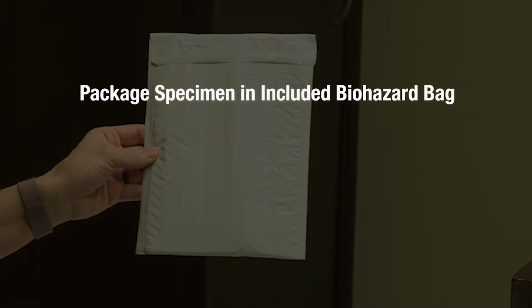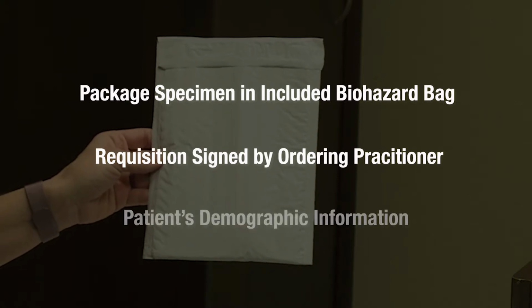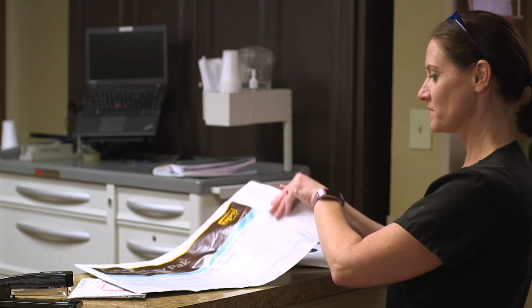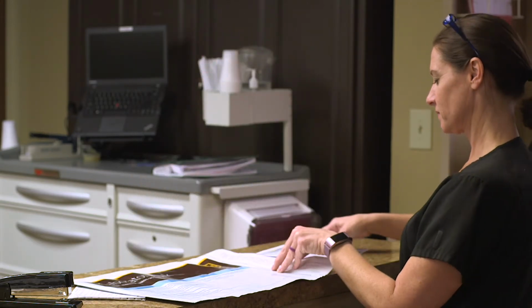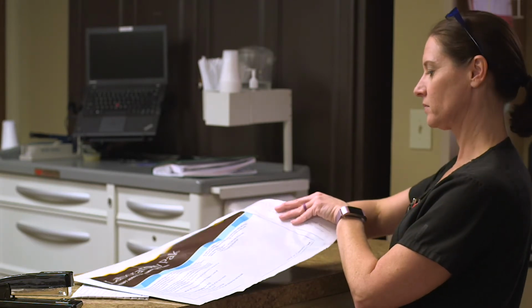Package the specimen in the included biohazard bag, along with the requisition signed by the ordering practitioner and the patient's demographic information. Place all of the specimens that have been packaged in biohazard bags into the provided Proximity Healthcare bags and place those bags inside the FedEx shipping box.